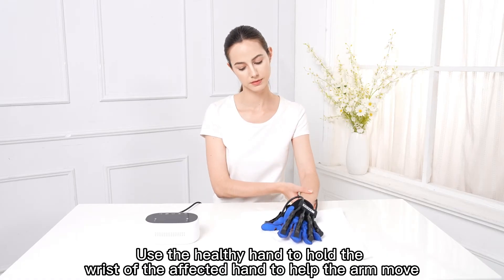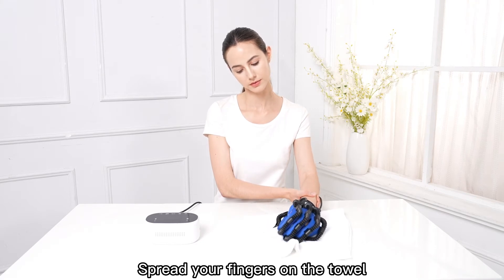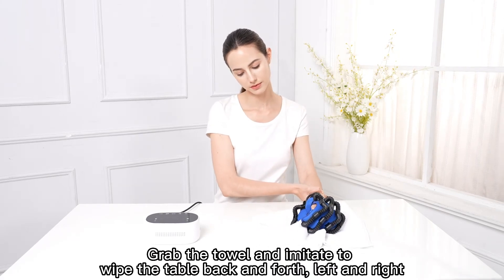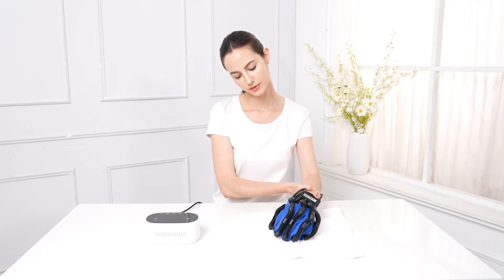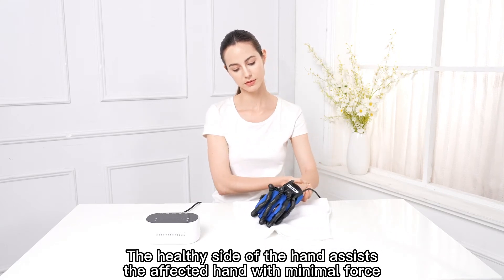Use the healthy hand to hold the wrist of the affected hand to help the arm move. Spread your fingers on the towel. Grab the towel and imitate wiping the table back and forth, left and right. Draw circles to wipe the table. Keep the affected arm as straight as possible. The healthy hand assists the affected hand with minimal force.